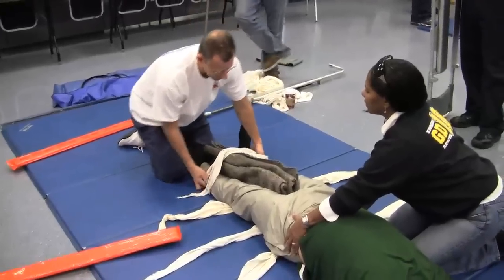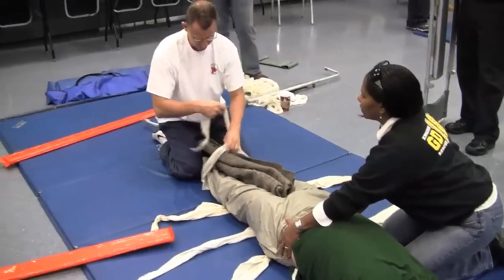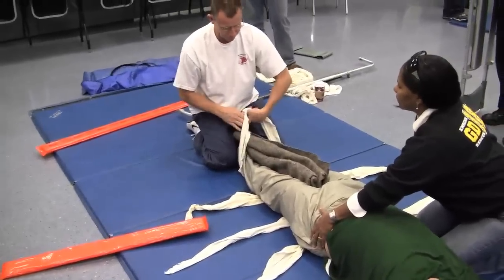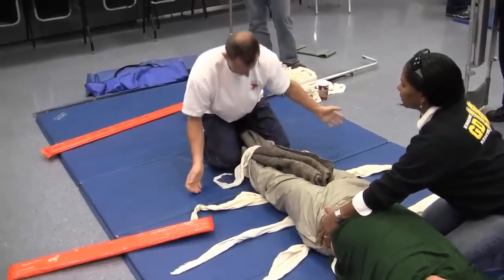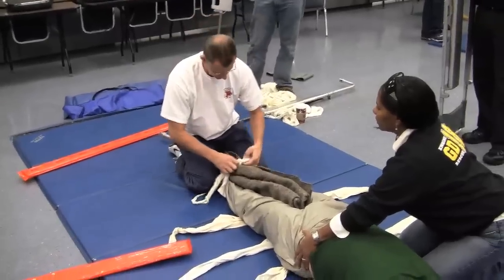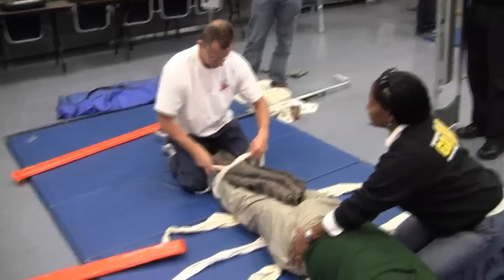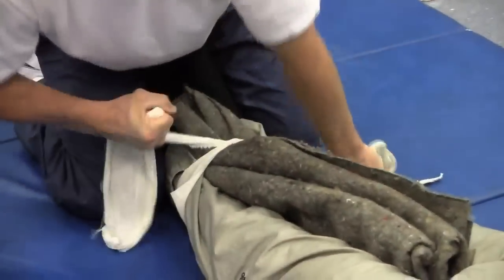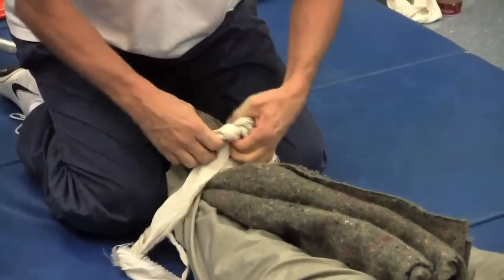So what you can do is — I always move it over and put my feet like so. You can do a surgical knot: wrap three, pull one, like so. That's kind of tight; some of you won't be able to do that. If you don't want to do it that way, you can go with one, pull it down. Remember, I'm tying bows so we can get them back out. You would tie knots in actual practice.